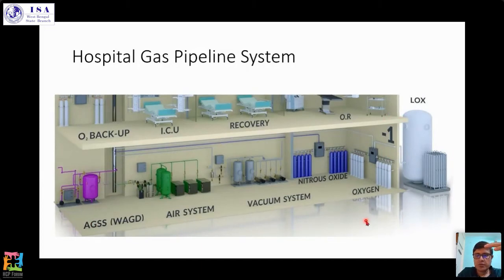In many of these cases, they have to be properly insulated. There has to be proper ventilation some of the time. The fire safety has to be adequate. And sometimes they're situated outside of the hospital. This is the liquid oxygen container and the liquid oxygen supply system, with the heat exchanger installed outside. The liquid oxygen container is always outside the building.